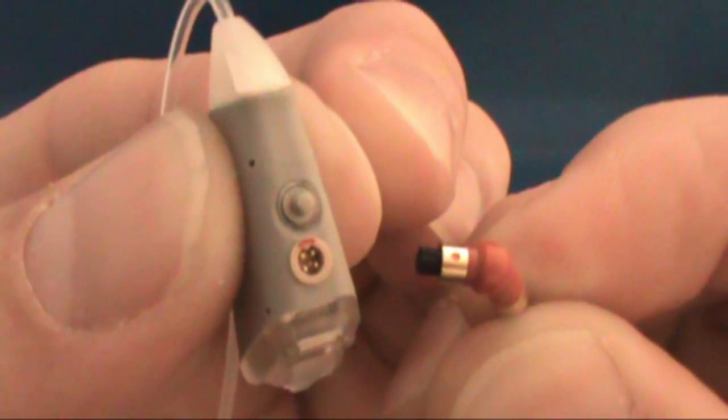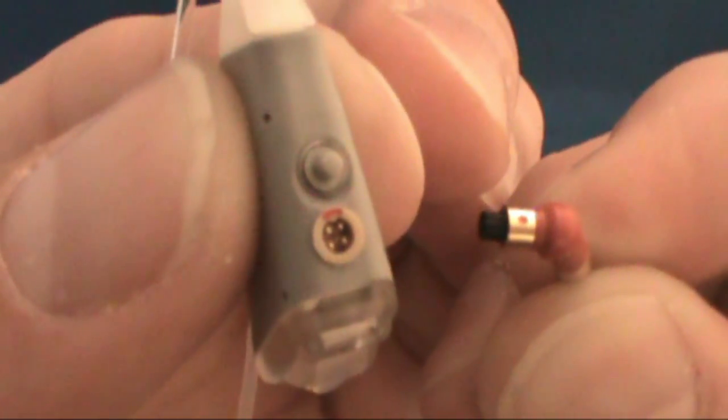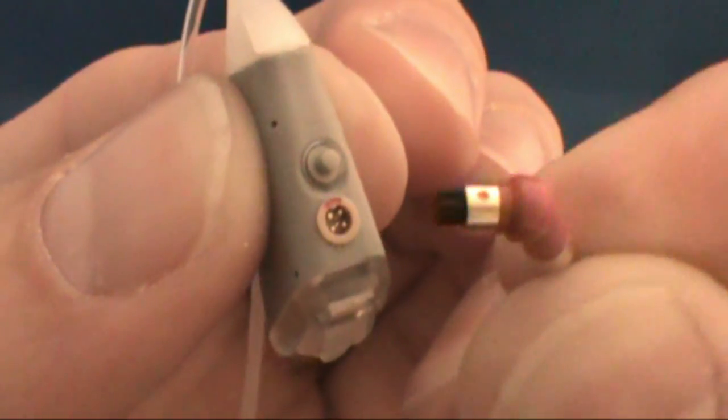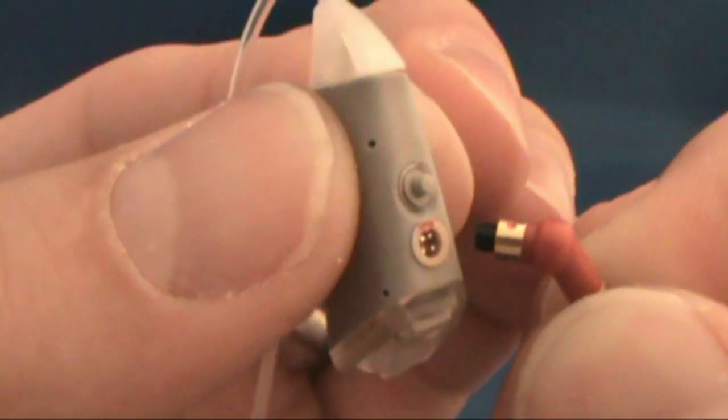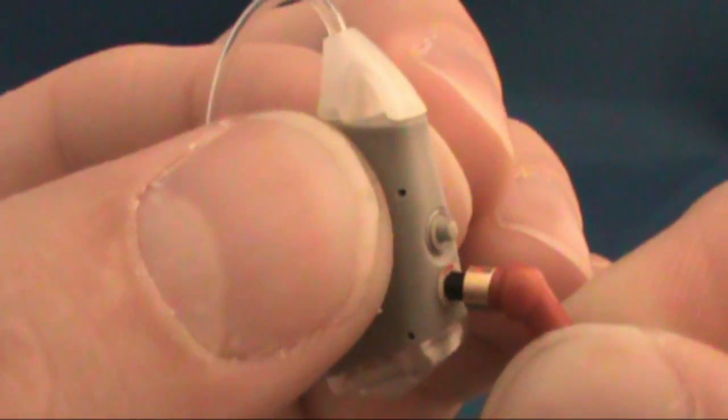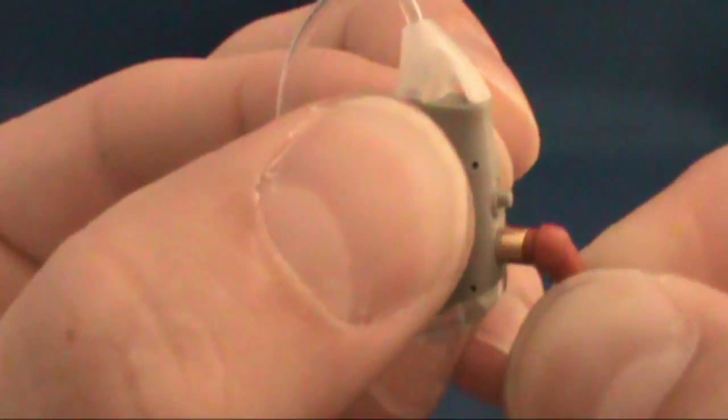Notice the red dot on the programming socket. Now notice the red dot on the programming cable. Lining these dots up aids in the insertion of the programming cable into the hearing aid. Gently push the cable into the socket.